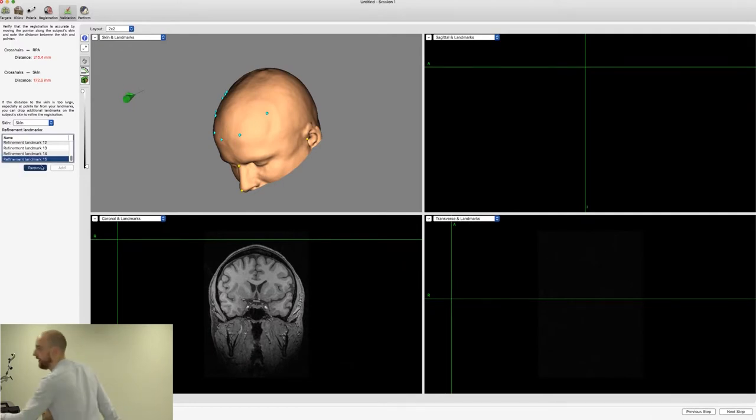Okay, yeah, so that one there, that's good. So that's really good there. So we got an incorrect landmark there. So we sampled something that was over here. So what you can do with that is, because we know that's incorrect, we can just go to that landmark and say, don't use this one because it's in the wrong place.